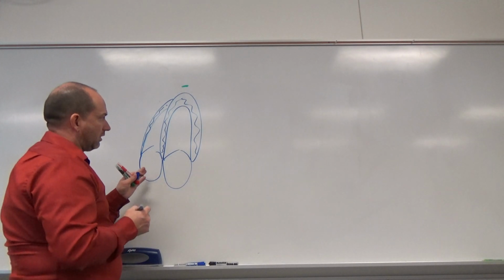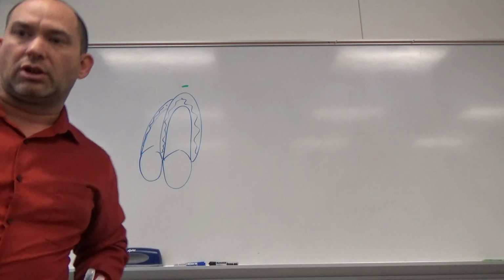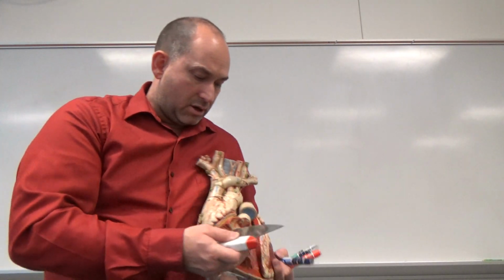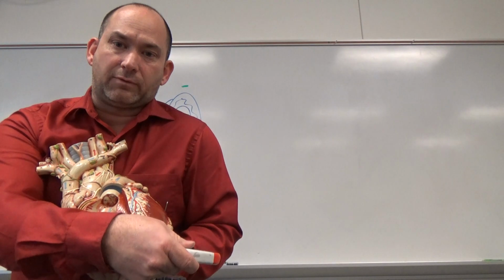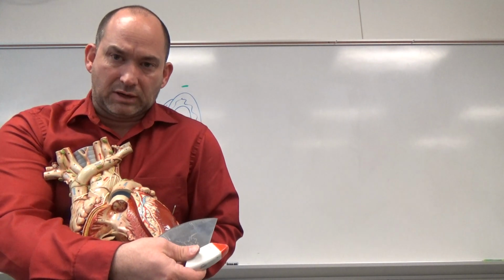From this view, if we're getting this incorrectly and we're mal-rotated, not rotated enough, and the rotation on this, by the way, is to have the indicator on the patient's left side, but more toward the floor, and turned up this way just a little bit, okay? So we're coming in from here, we've got this in, we're at the apex. We want to be in line with the four chambers, so you can see that it's kind of rotated up just a little bit with my sector. It's not down to the floor, it's up just a bit. Okay, then I'm going to sweep it up anteriorly to get the aortic valve in later.